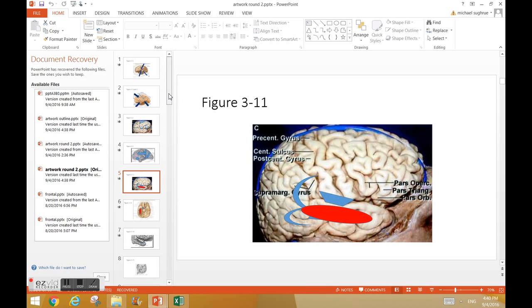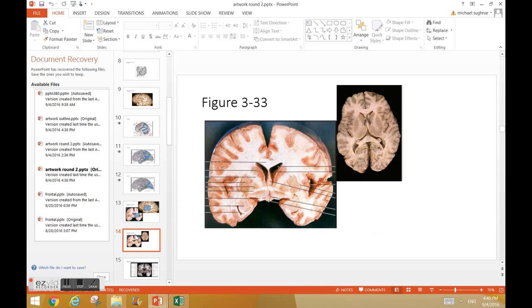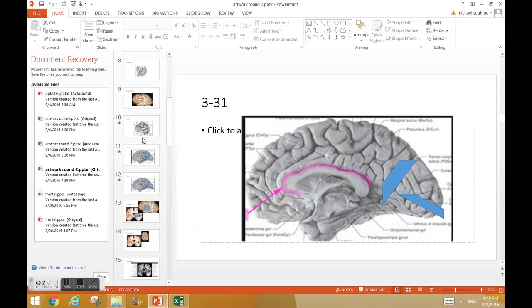Now, we're going to go to a coronal image, just to give you some reference points. The SLF is approximately here, and as we're coming down, we want to make sure that you don't go too deep and cut across the SLF. So our cut's going to be like that in the coronal plane. And so we're essentially going to march down and stimulate multiple times.